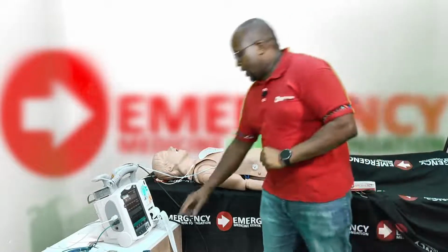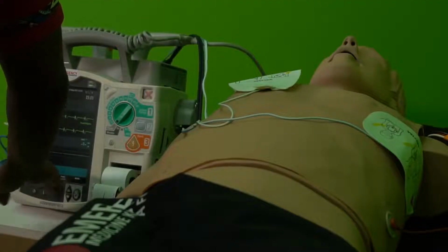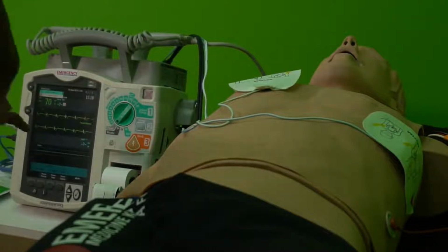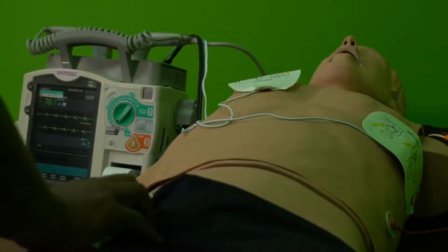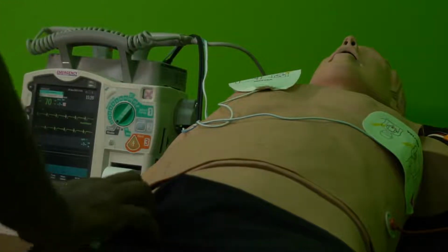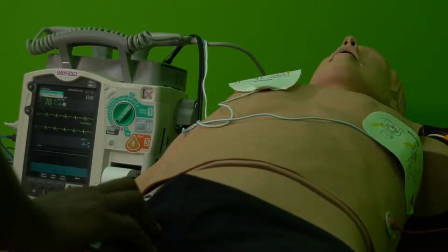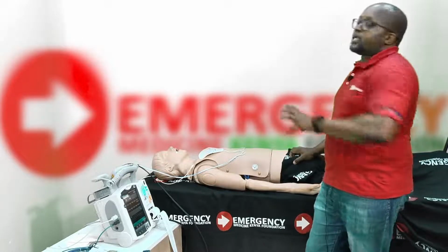All right. Now, troubleshooting again. We had initially gotten capture at 70. So I have electrical capture. Good. Every spike is followed by a wide QRS complex. And I feel for the pulse. I'm feeling 70 beats per minute, which is exactly what is on the screen here. I can feel a pulse at 70 beats per minute in the right femoral. So I have electrical capture and I have mechanical capture. Now let me check again.